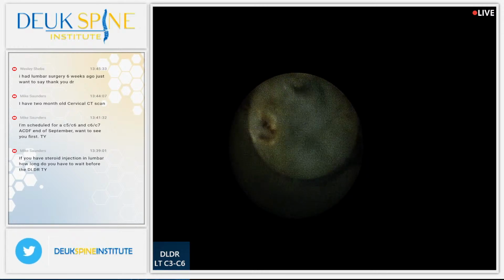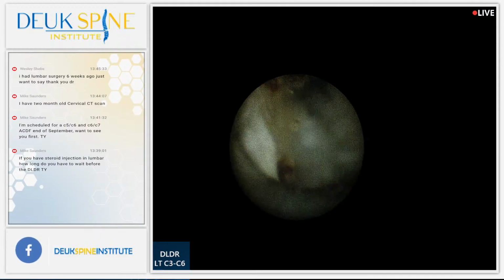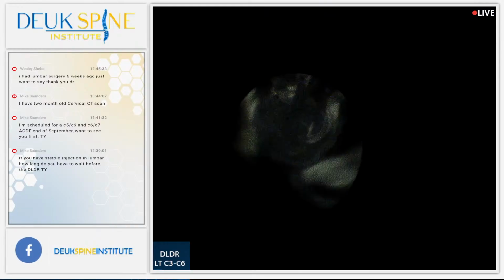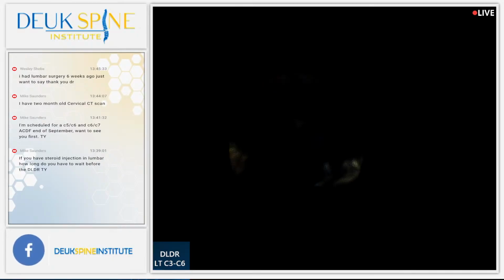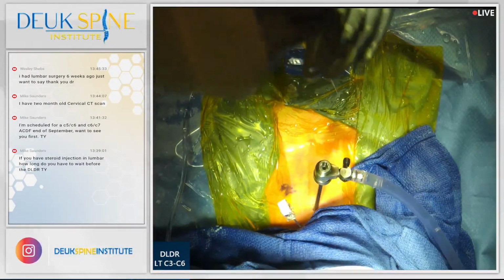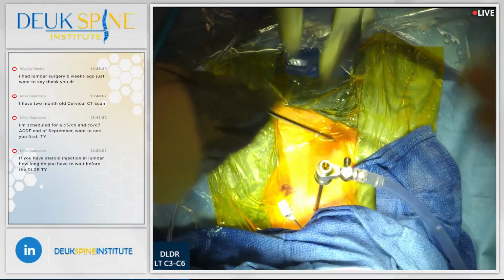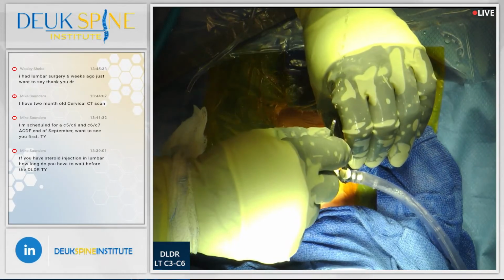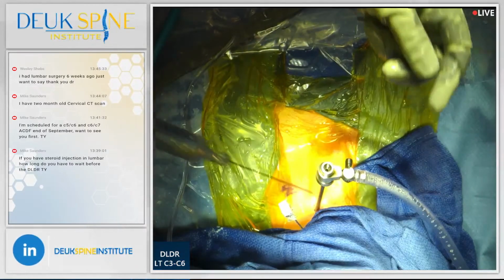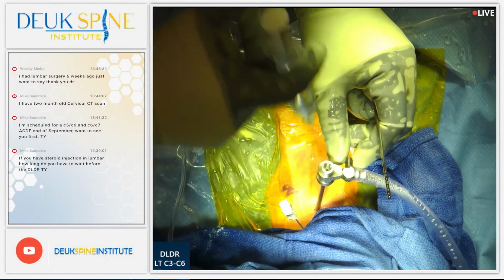All right. We are just about finished. I don't see any more herniation. It looks good. We're done. 2 more, please. Thank you. We're going to irrigate it out with some antibiotics. Very dilute antibiotics, so not too concentrated. And then I'm going to irrigate out the antibiotics.